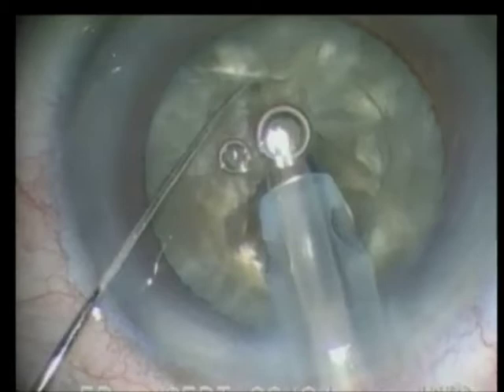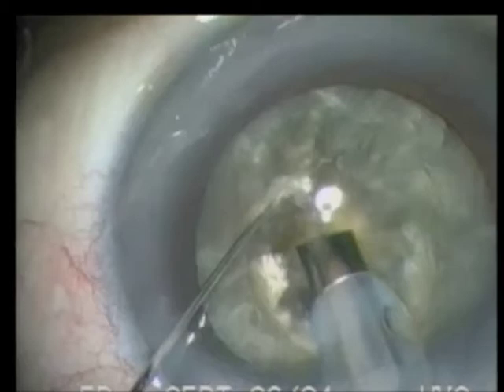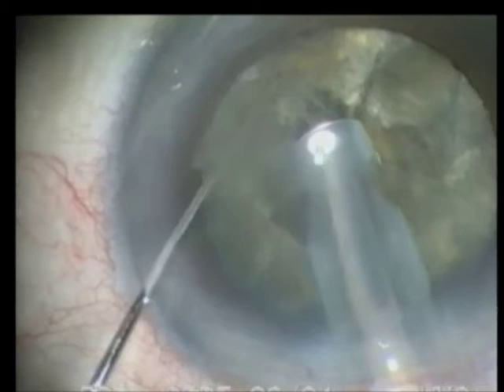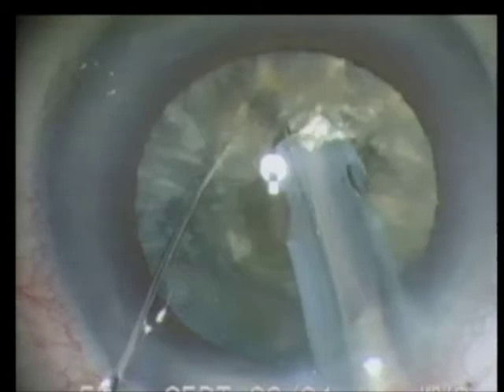After the first chop, the nuclear rim is rotated, and the same procedure is repeated over and over again until the rim has been completely divided into segments. I leave the chopped segments in place to maintain the distension of the posterior capsule. This facilitates further rotation of the nuclear rim. Here you see the split occurring and also some separation, using the two instruments not only to chop the nuclear rim but to separate the segments, extending the split into the posterior part of the nucleus that has been thinned.